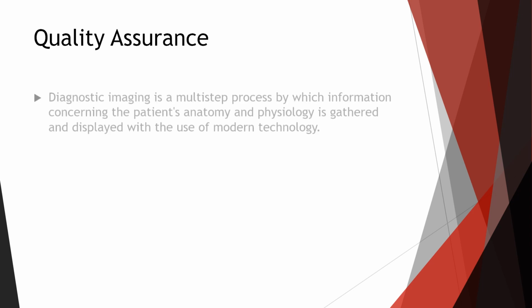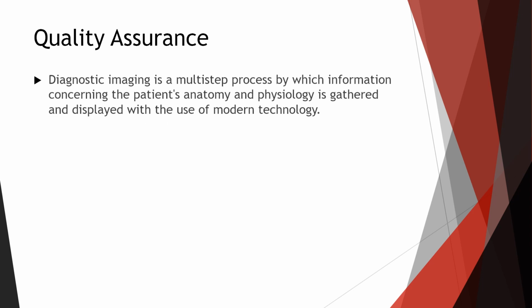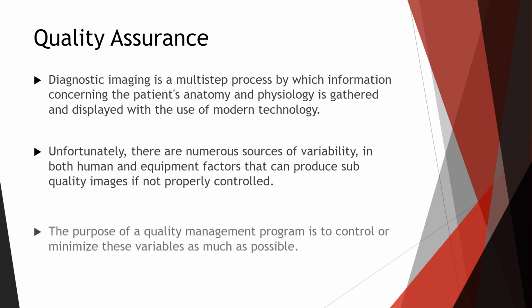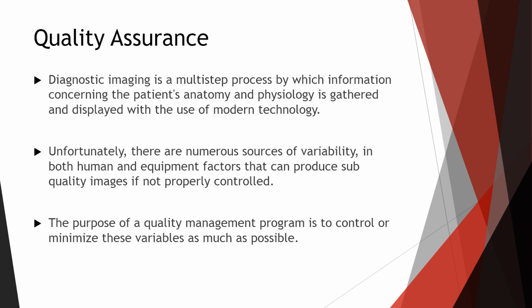Quality assurance. Diagnostic imaging is a multi-step process by which information concerning the patient's anatomy and physiology is gathered and displayed with the use of modern technology. Unfortunately, there are numerous sources of variability in both human and equipment factors that can produce sub-quality images if not properly controlled. The purpose of a quality management program is to control or minimize these variables as much as possible.